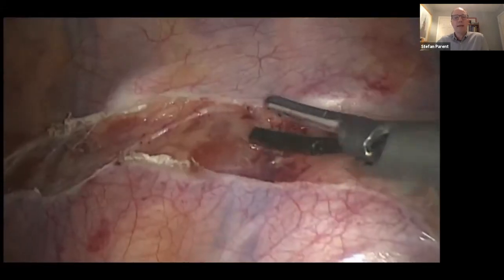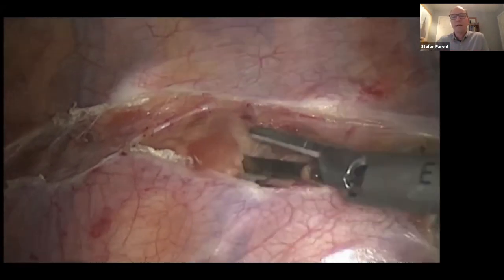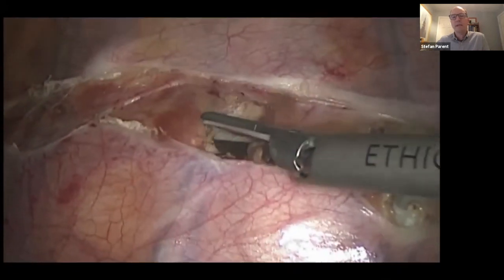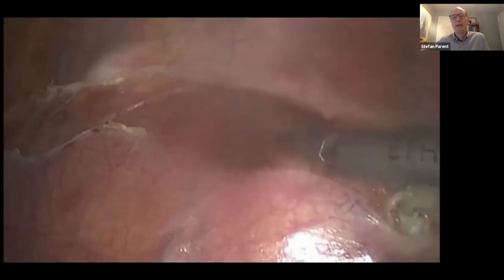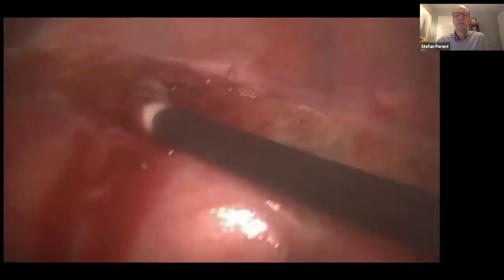What to do when it bleeds? Well, first, don't panic. So you're hovering on your vessel there, and sometimes it doesn't take much for major bleeding to start. You'll see what happens then is that you quickly blur your camera, and then you start panicking because you say, well, what's going on? What's happening? So first, take a deep breath. Put something on top of it. You have a peanut or something like that, and then clean up your video camera and go back in.